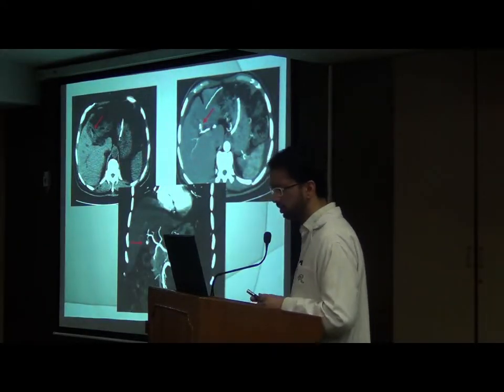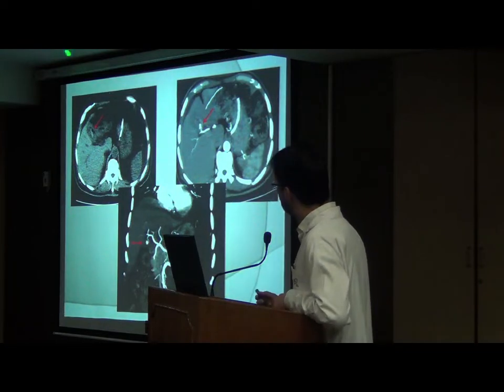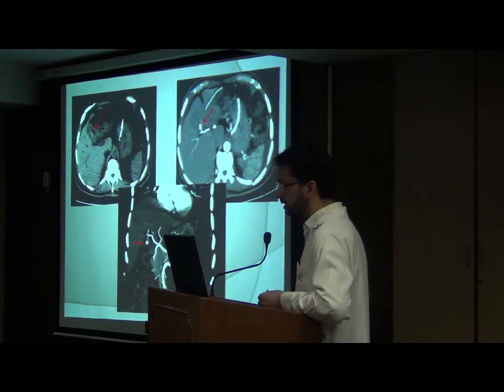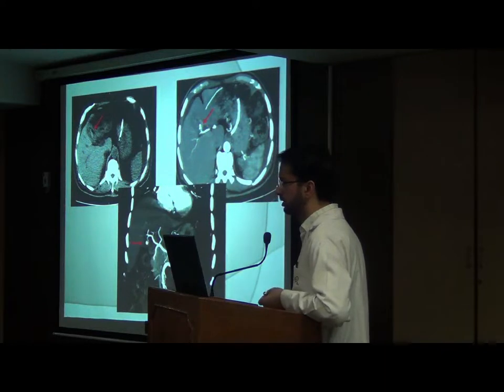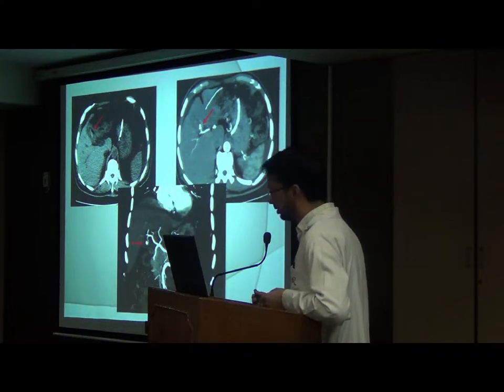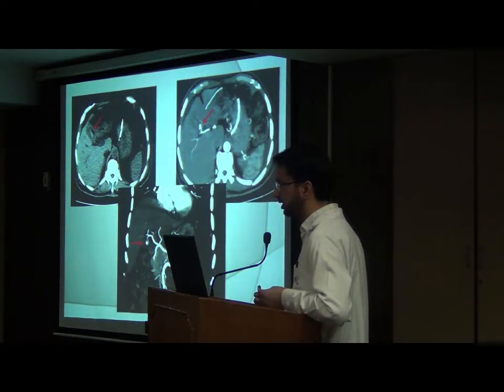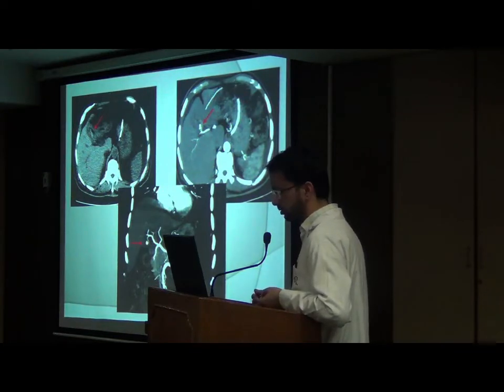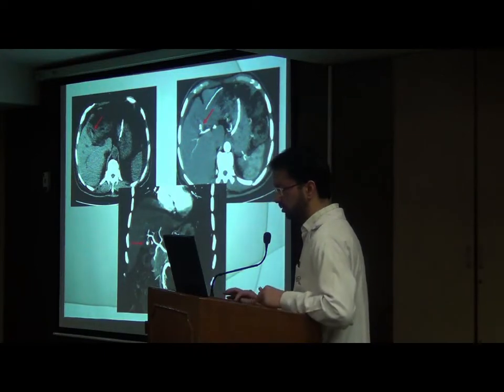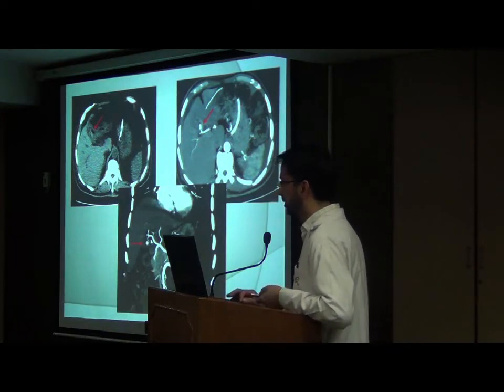These are the images. This is the plain CT image showing hyperdense contents in the lumen besides some air foci. The hyperdense contents are possibly due to hemorrhage and the air foci are because of the fistula. The CT angiogram images show the pseudoaneurysm arising from the cystic artery, again in the coronal view. Note in all these images that the pseudoaneurysm is supplied by the cystic artery — a very small caliber artery in this case.